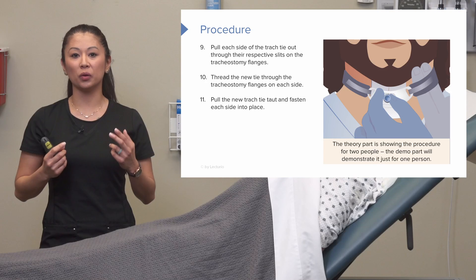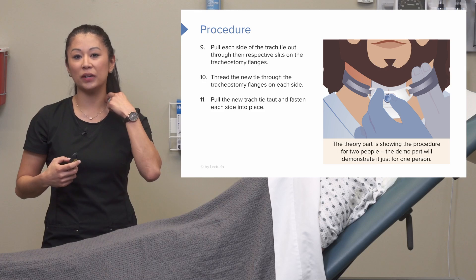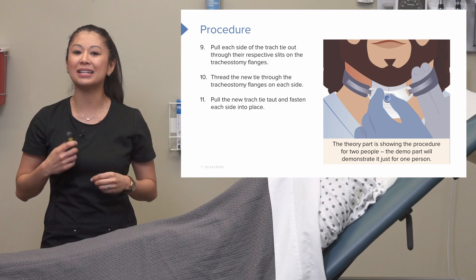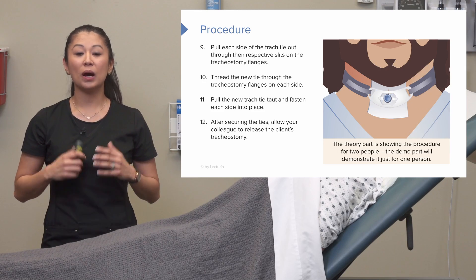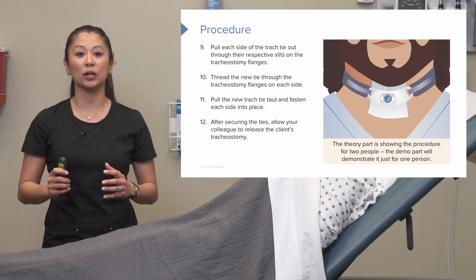Here's a good rule of thumb when we fasten this: we want to make sure we can get at least one or two fingers underneath. We want it snug, but not too tight. After securing the ties, allow your colleague to release the patient's tracheostomy.